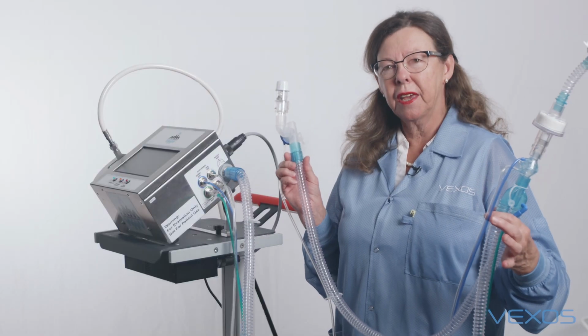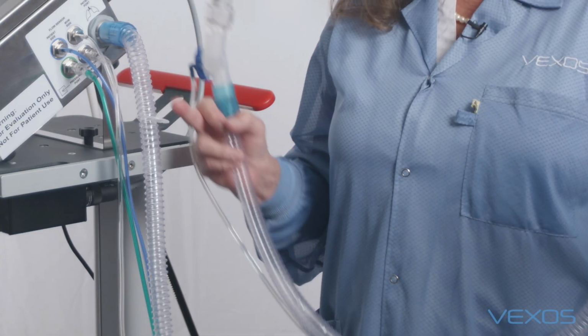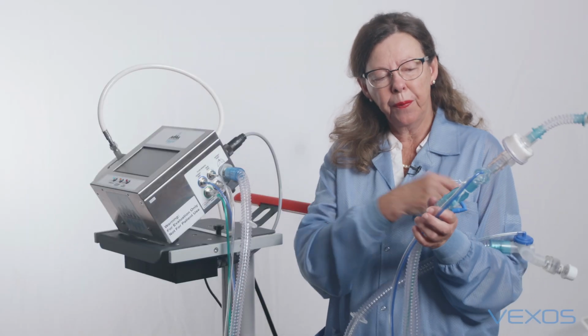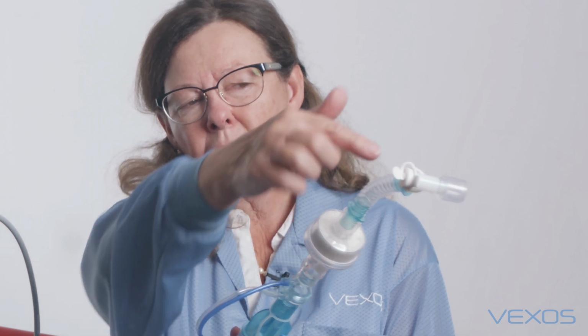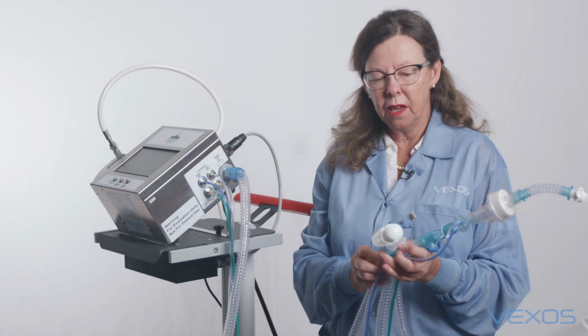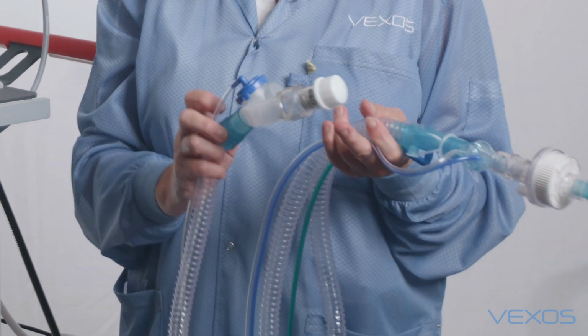The patient circuit that comes with the MVM ventilator consists of the following components. The inspiratory limb, the long tubing here, is attached to the Y piece, which then has a flow sensor with 2 lines that need to be attached, the heat and moisture exchanger filter. After that, a short piece of tubing, followed by the patient connection adapter. On the expiratory limb, we see the shorter expiratory limb, including the expiratory valve and the PEEP valve.